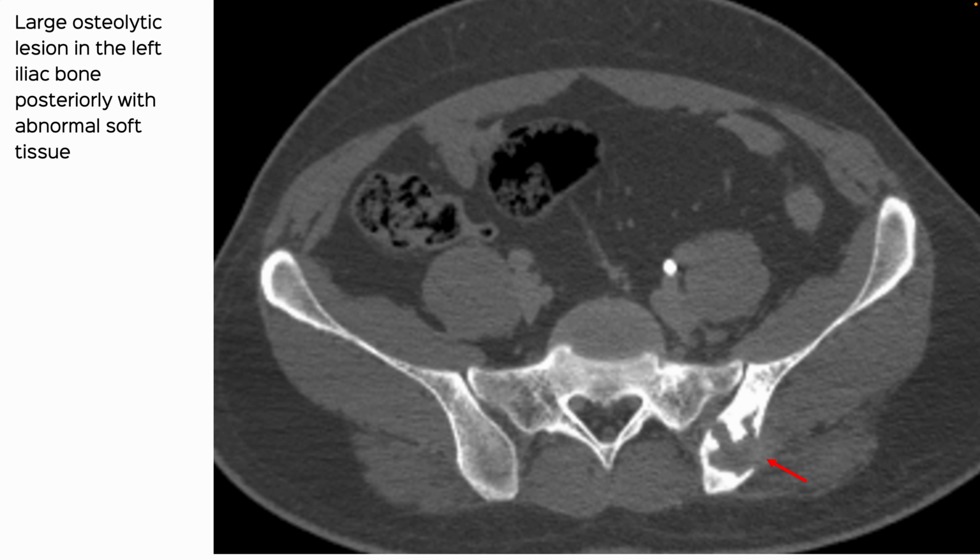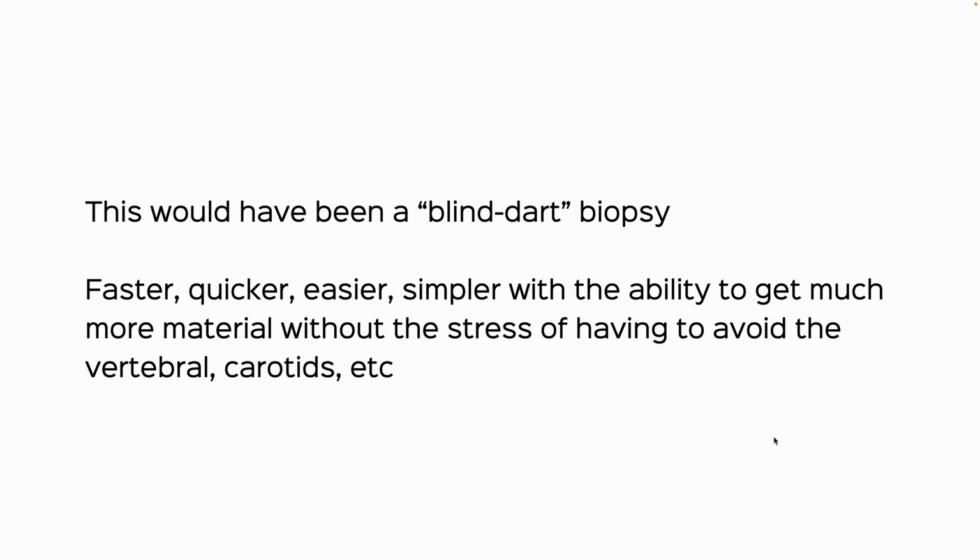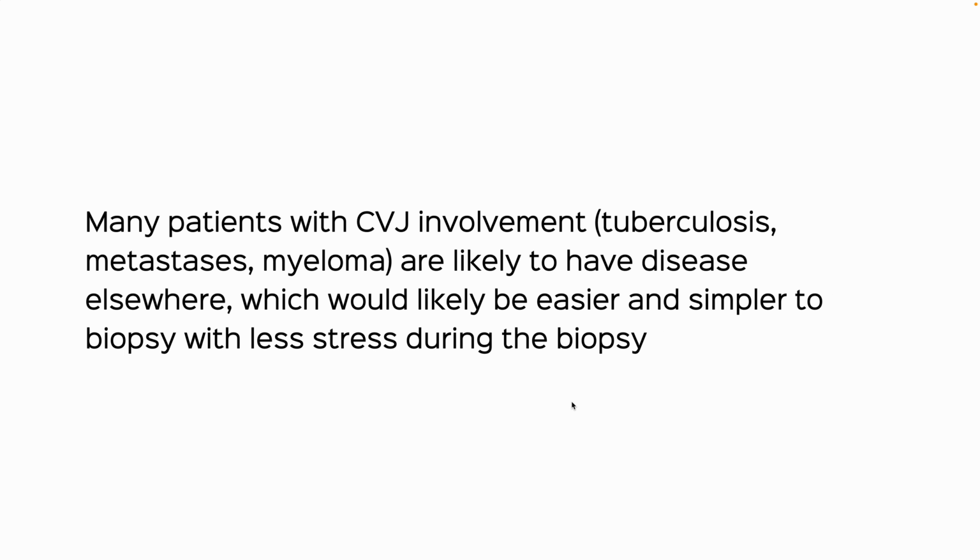Faster, quicker, easier, simpler. The CVJ took me 21 minutes, and normally these biopsies shouldn't take more than 10 to 12 minutes from the time you put a marker to the time you wash out. And you can get much, much more material. So if I had thought about it, because many patients with CVJ involvement, whether it's TB, METS, or myeloma, are likely to have disease in some other bones, and it would have been so much simpler.